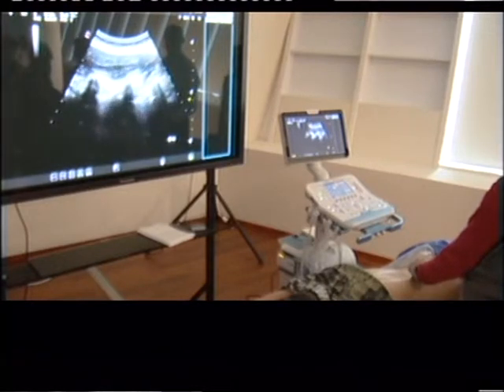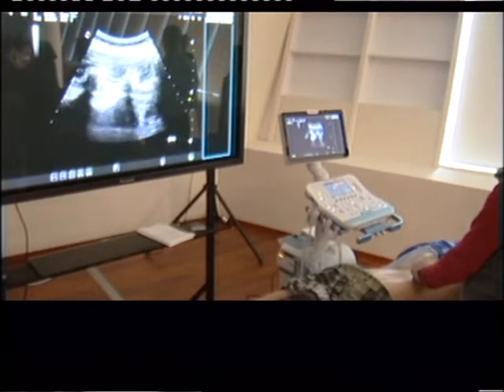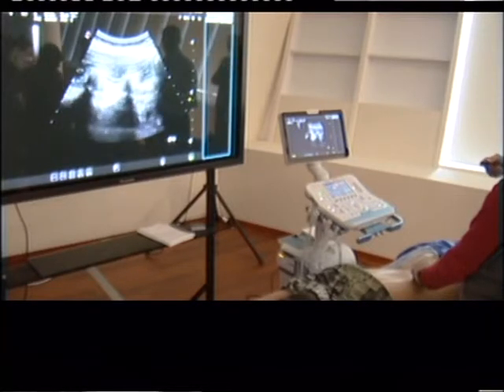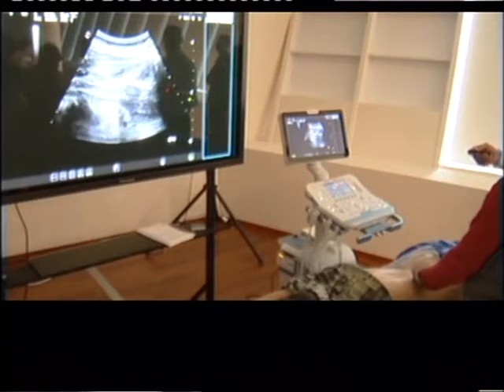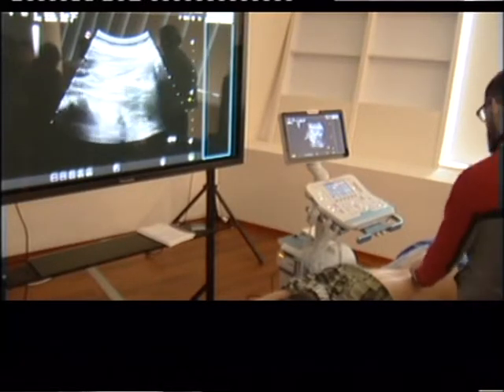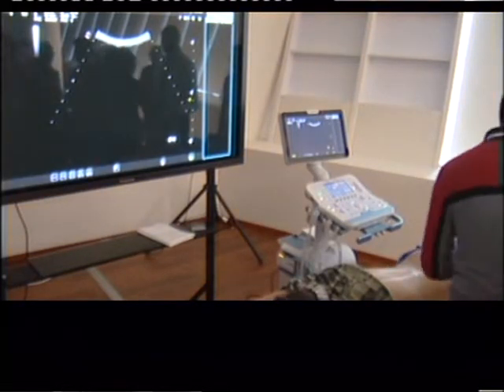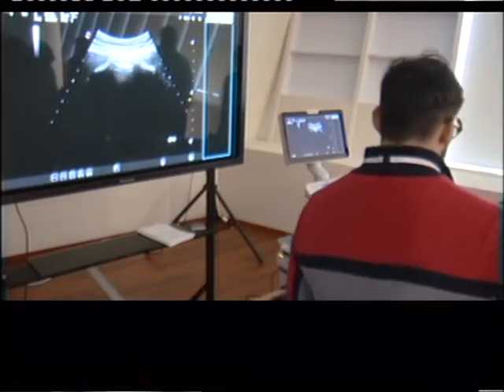These are the transverse process. No, this is the nerve roots. Okay, now go more lateral. Now lumbar plexus. Keep going lateral. More. Now no transverse, just psoas. Okay, thank you. One more, last one. I think that's good.